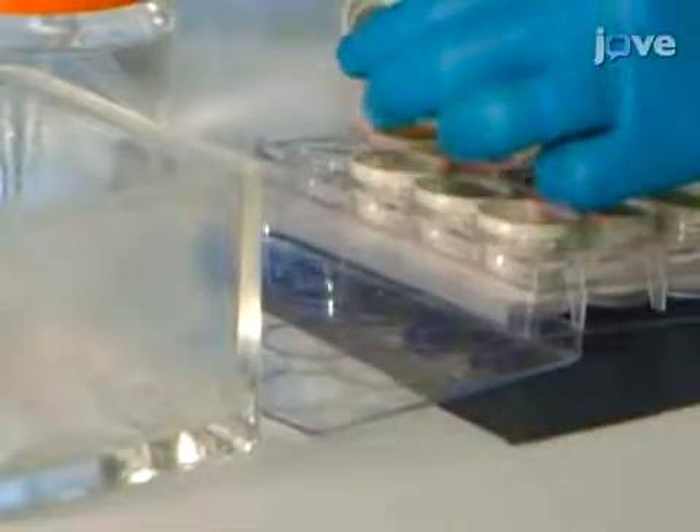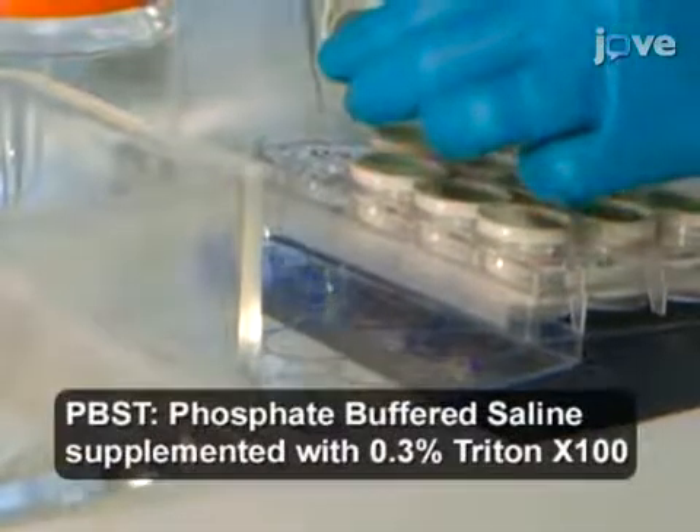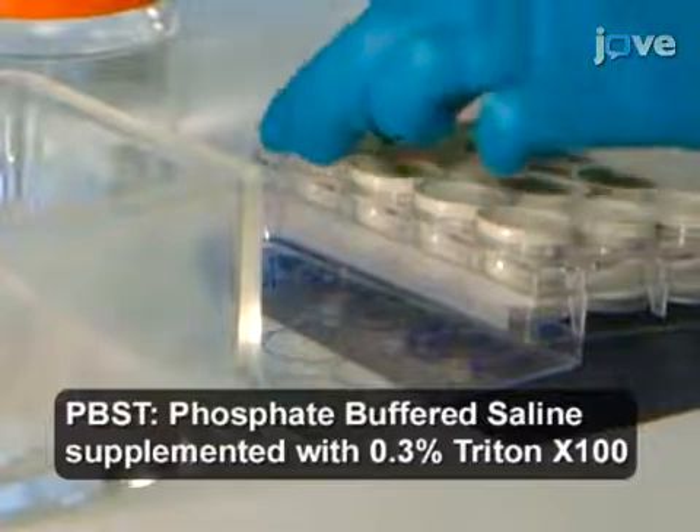Block nonspecific binding sites by incubating the coronal sections with 2% goat serum in PBS-T for 1 hour at room temperature.